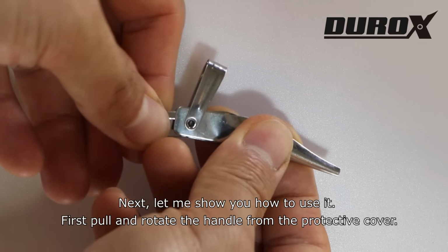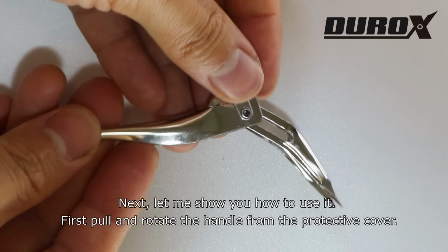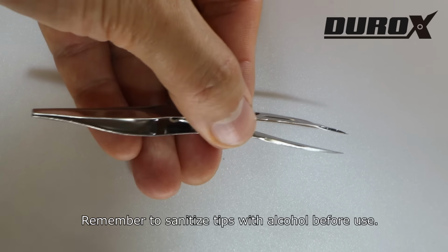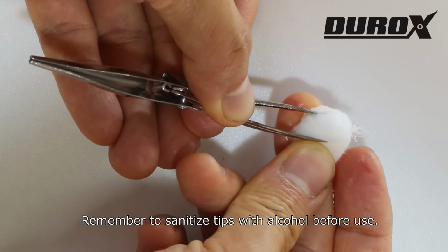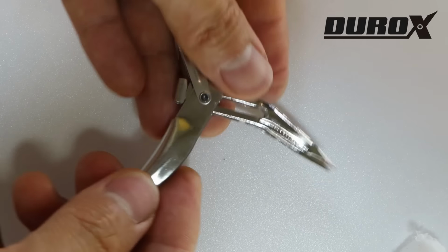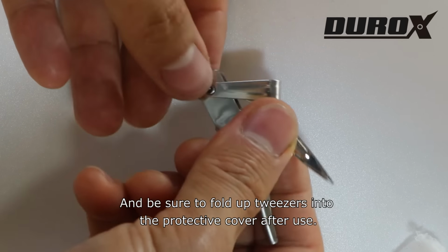Next, let me show you how to use it. First, pull and rotate the handle from the protective cover. Remember to sanitize tips with alcohol before use. And be sure to fold up tweezers into the protective cover after use.